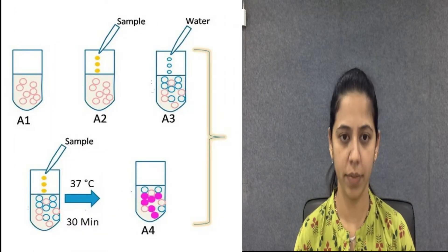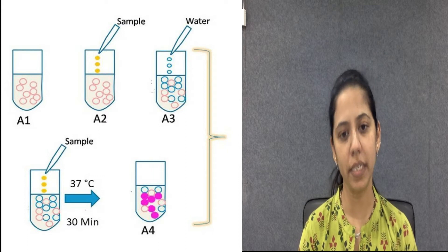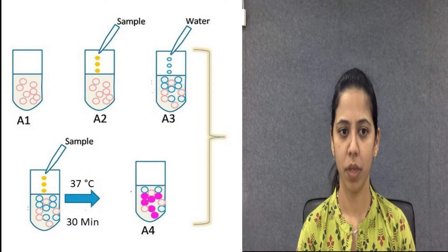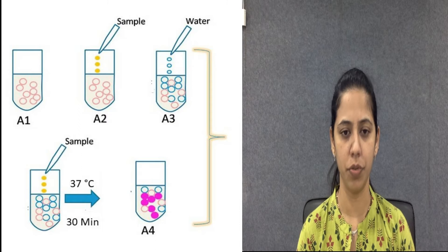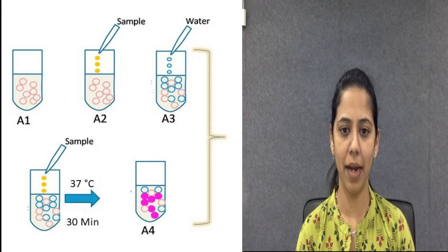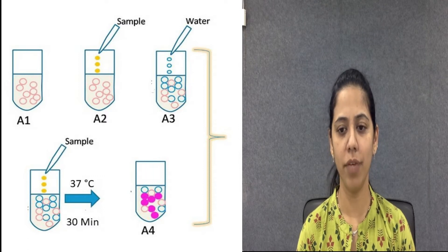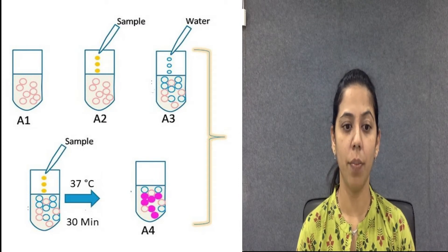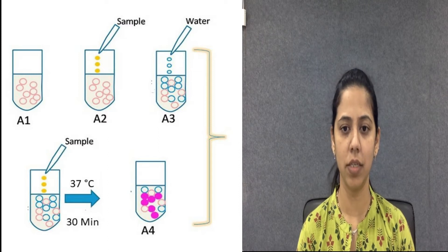For the Biuret test procedure, we need three test tubes. Thoroughly clean and label them blank, standard, and test. To the blank test tube add 3 ml of water solution, while to the standard and test tubes add 2.9 ml of water solution. In the standard test tube add 0.1 ml of working standard protein, and in the test tube add 0.1 ml of serum solution.